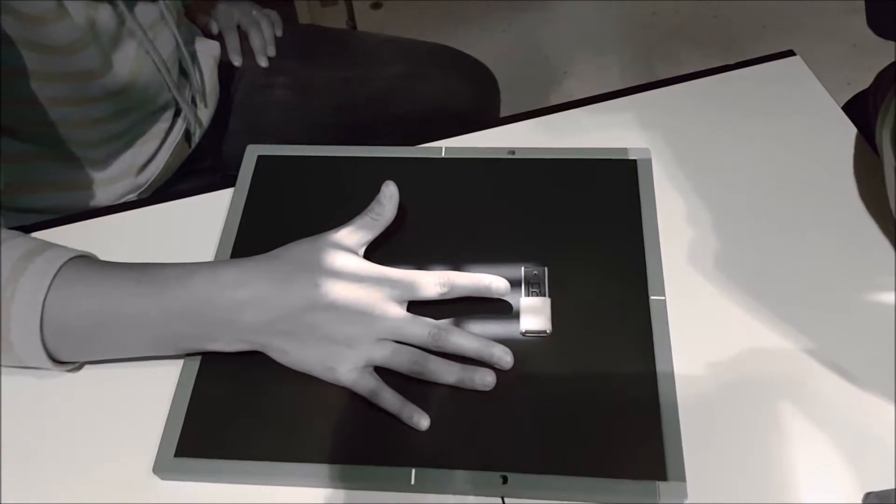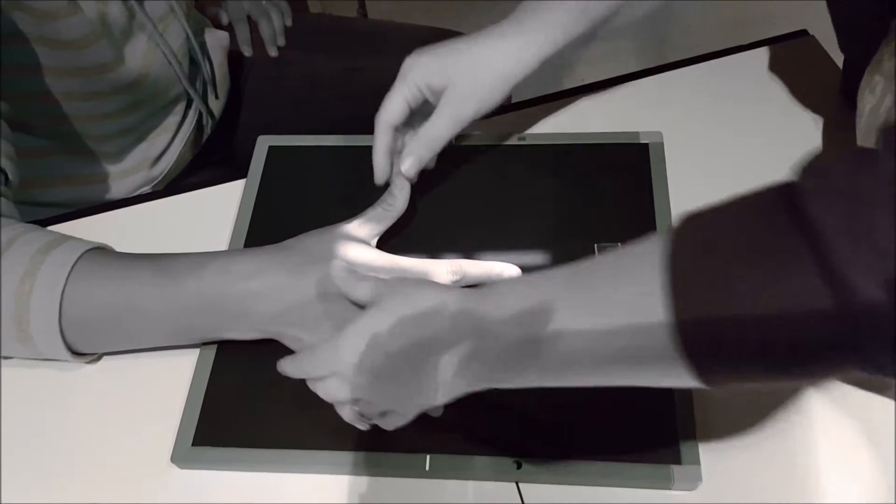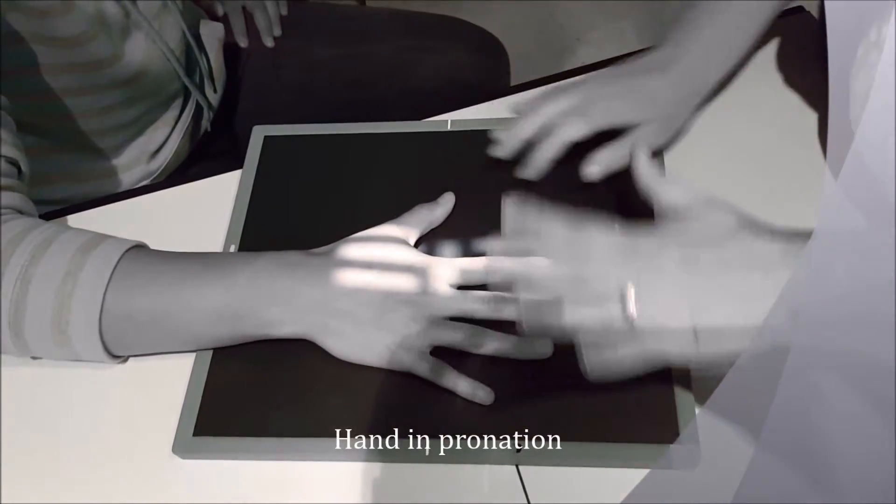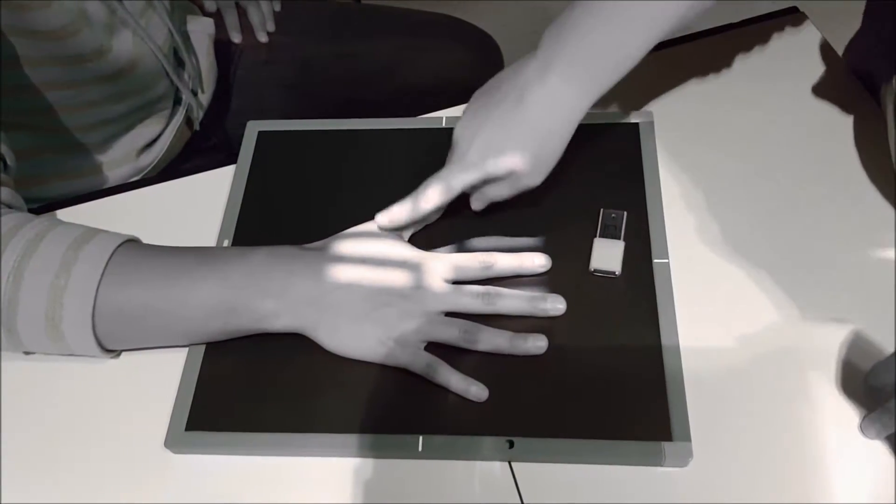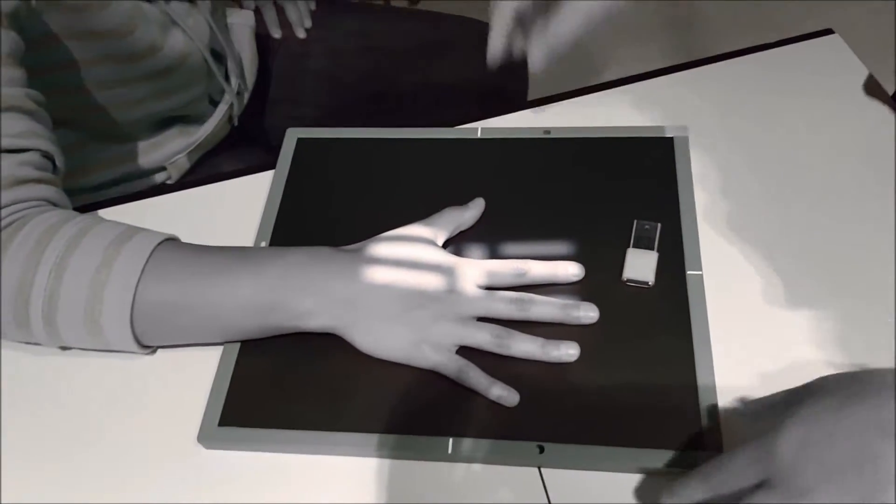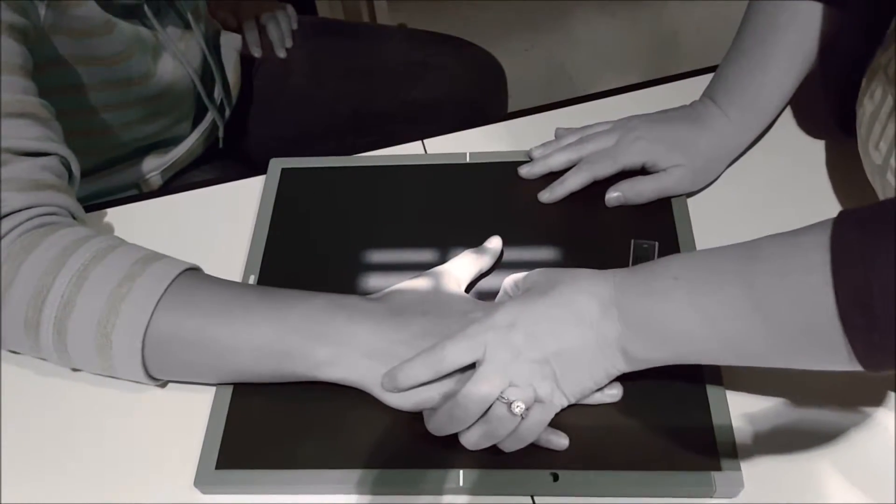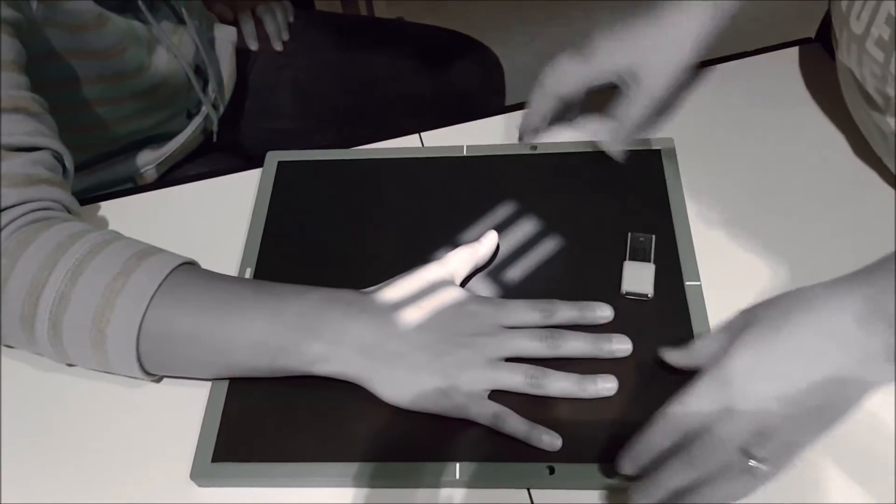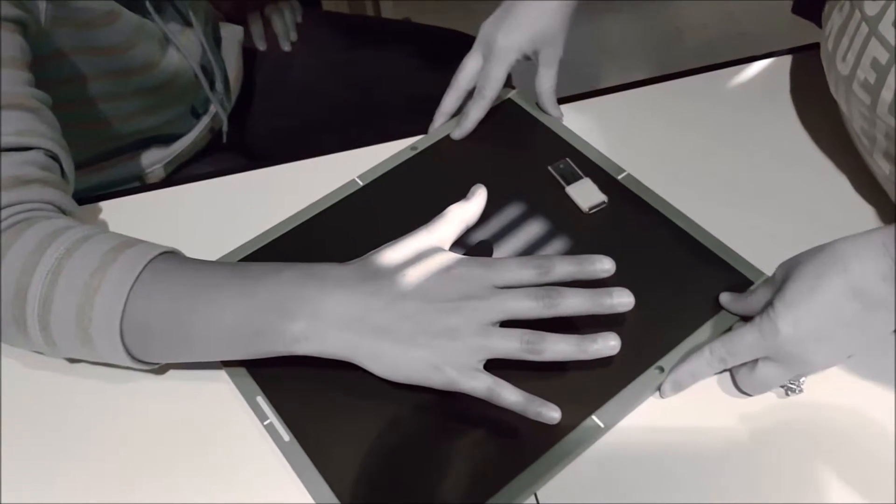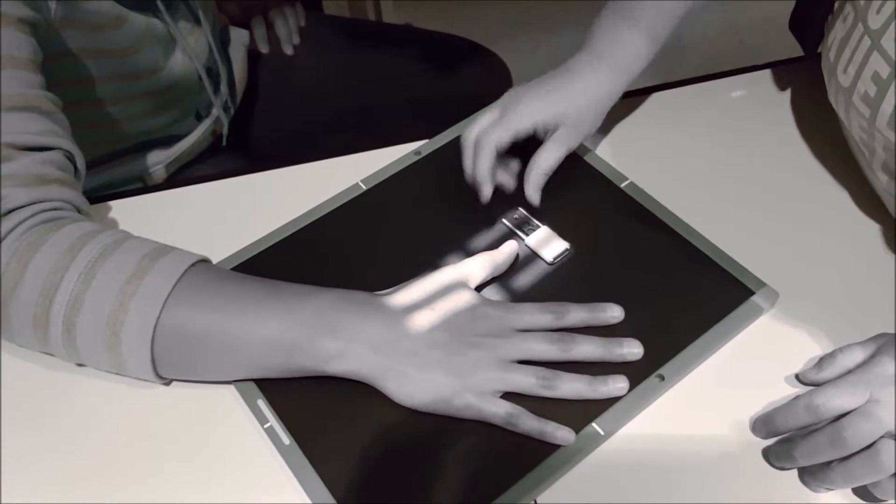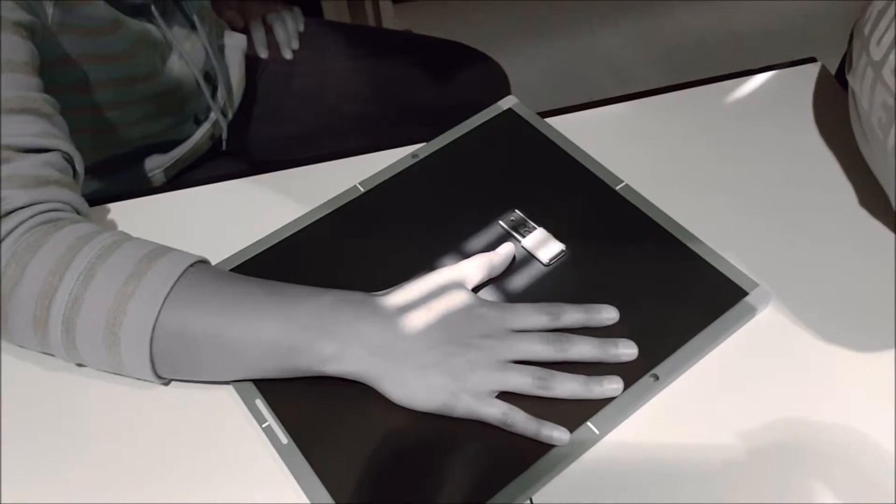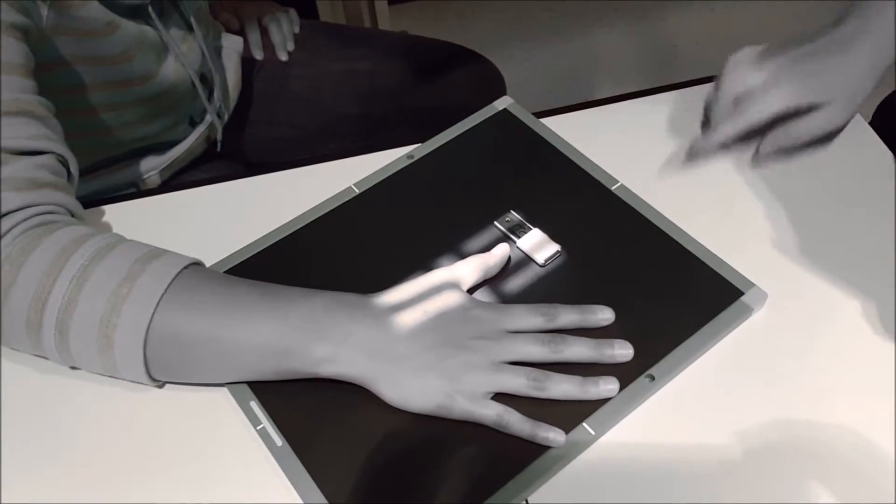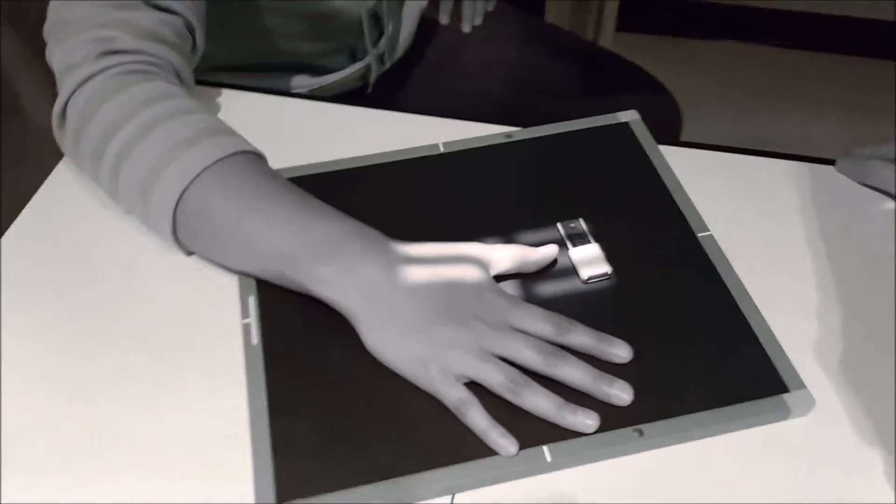For an oblique thumb, if you keep your patient's hand just flat, as if you're doing a PA hand, the thumb is already in an oblique position. Lift up your hand for just one second, go ahead and relax it back down. That would be your oblique thumb. The patient's hand is already relaxed and the thumb is in an oblique position.